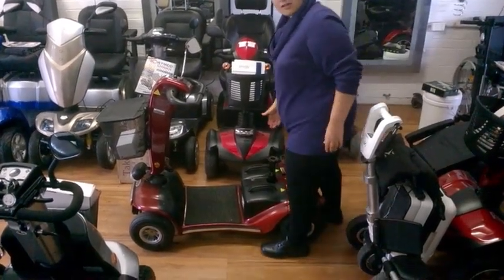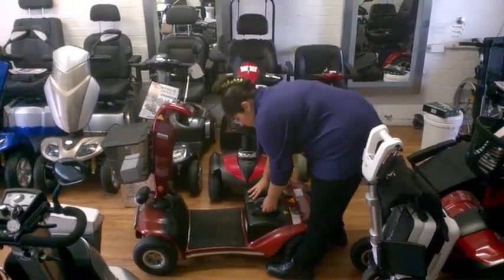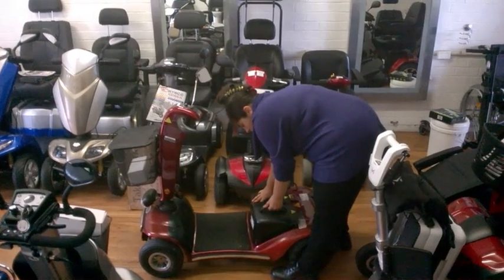The next step is to take the batteries off. Make sure the scooter is switched off first, since you are disconnecting the power. You can take both batteries off at once, or if it's a bit heavy, take one off at a time.